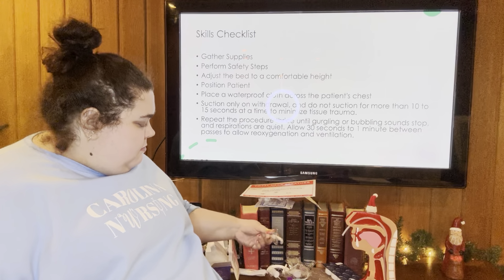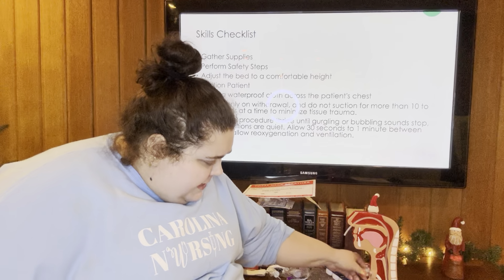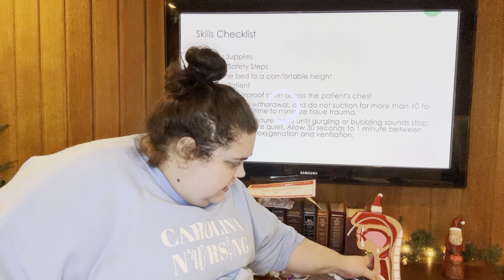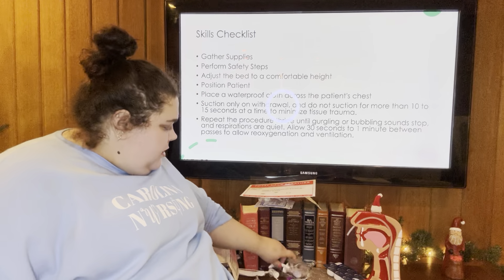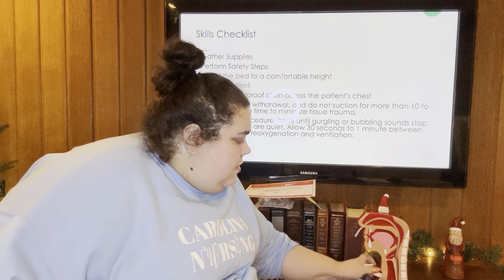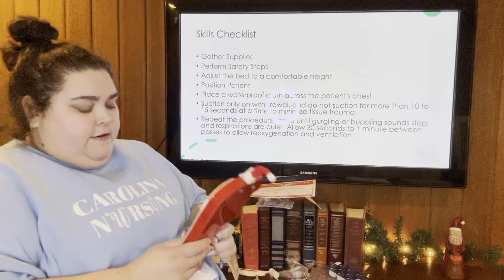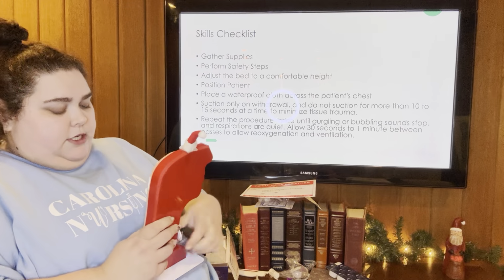So first we want a trach in the patient. That one's not going to stay. Put our other trach in there. Forgive me, it's hard to get in, sorry. Okay, so we want the trach in the patient.